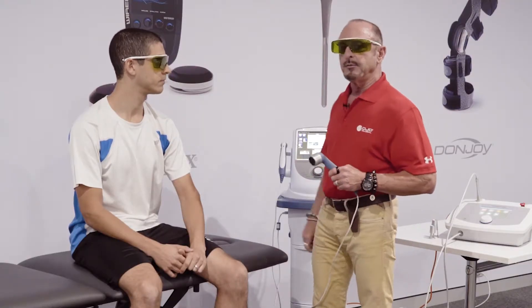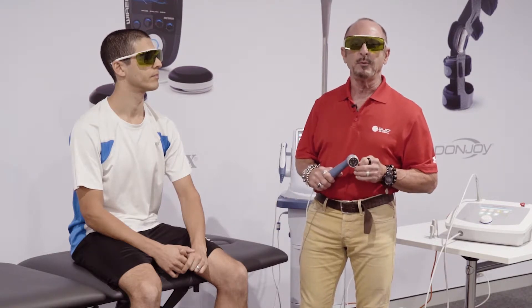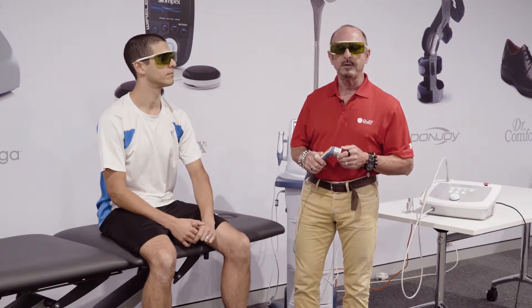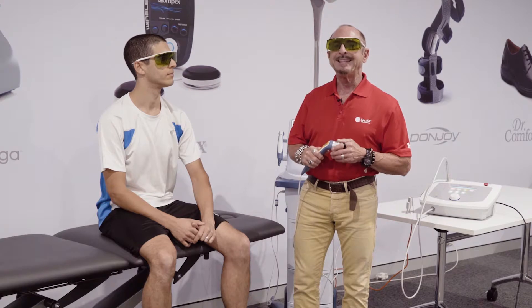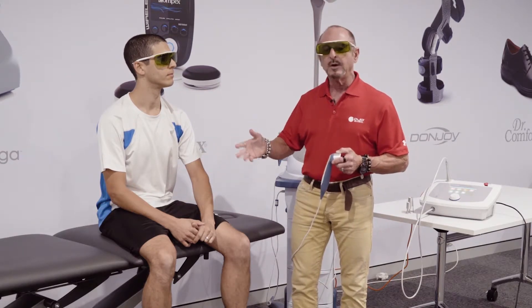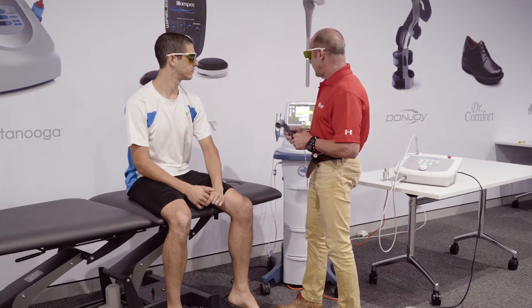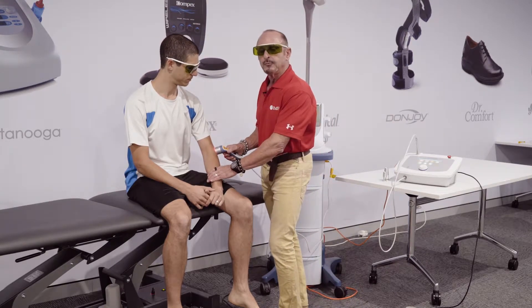For desired dosage, we know that 0.12 joules per centimeter squared is the initial biological threshold we need to engage biological activity. Based on that number, we could probably count on doing that at least six to eight times over that area. A little more will just scatter — we're not concerned with that, it's artificial radiation. We press start and begin our treatment.